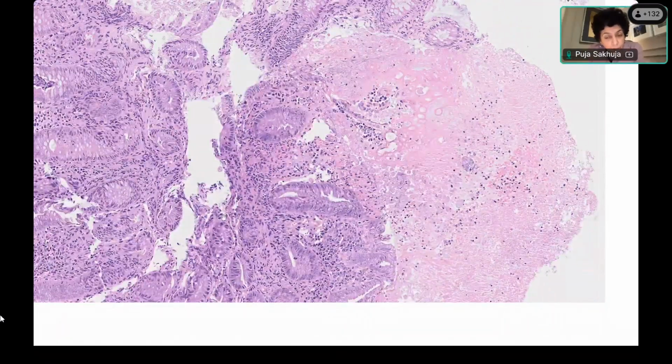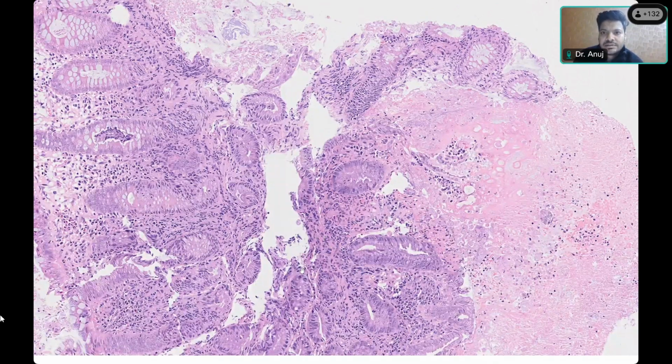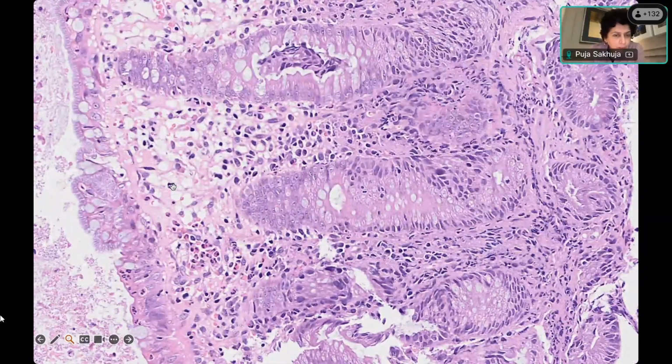Would I give you a case with just trophozoites of Entamoeba histolytica? Spirochetes were also there, I have a query. Spirochetes, yes, you are right. So here, look, there are so many neutrophils, which of course can be present with amoebiasis. You often see neutrophilic ulcers in amoebiasis.